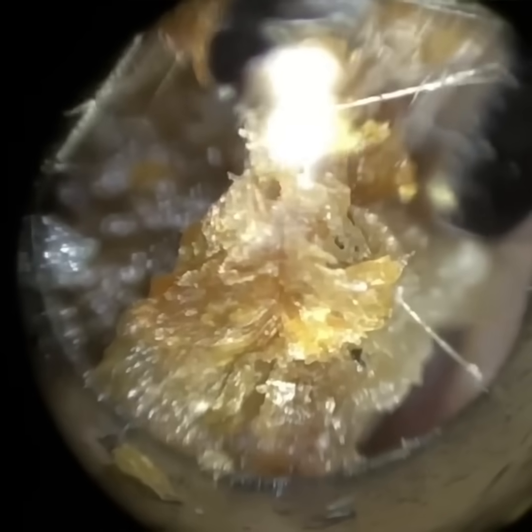Of course, if an object is further away, it means that you're farther away from it, and if it's closer, it means it's near to you. So moving the endoscope forwards and backwards can help you judge the depth. You use shadows, contours, and also something called motion parallax, which is another monocular cue.